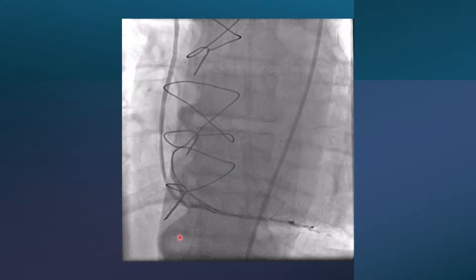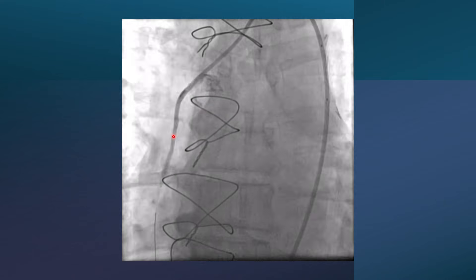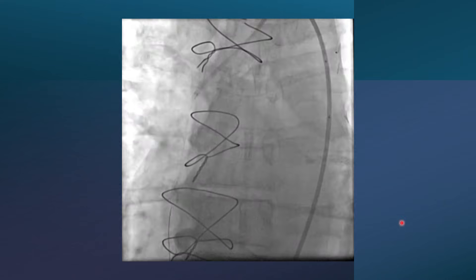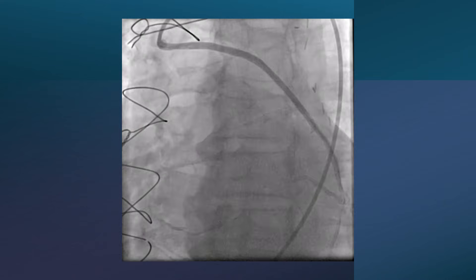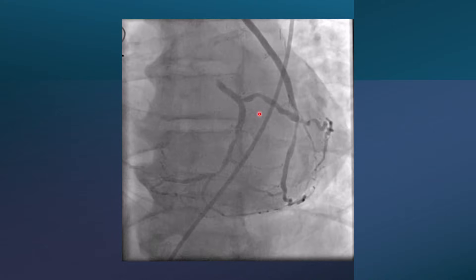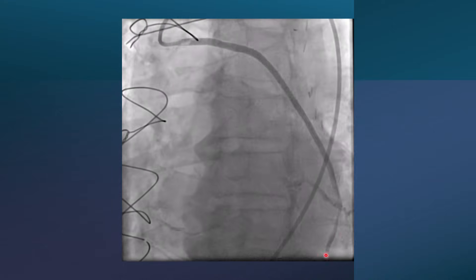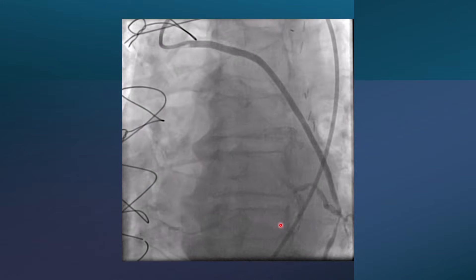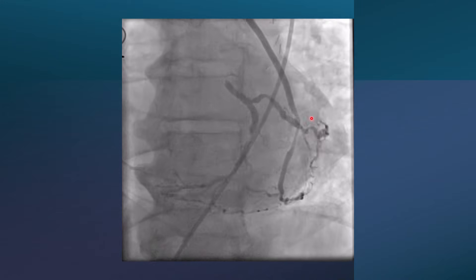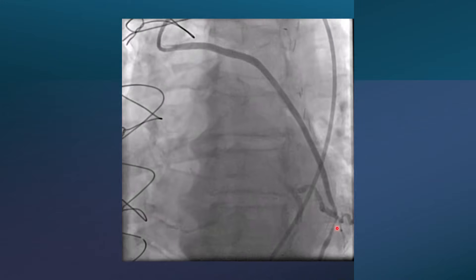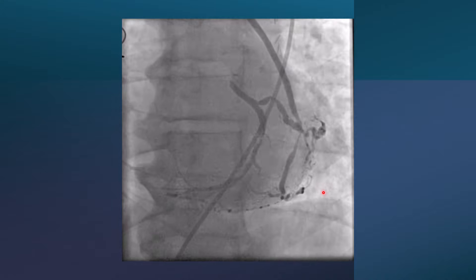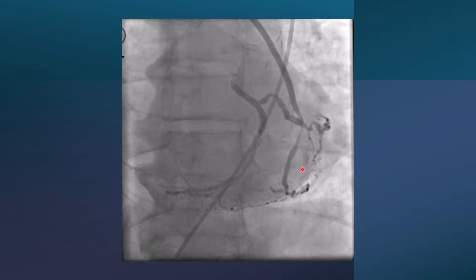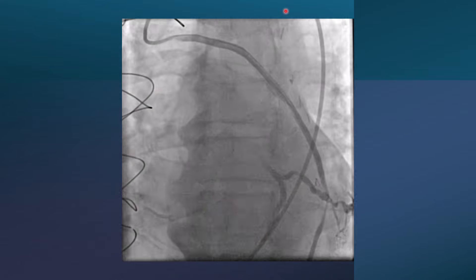This is the SVG to the RCA — it was stented by direct stenting at an outside hospital. And this is the SVG to the OM. The circumflex is a large artery with multiple branches, and the SVG is anastomosed to a large OM. However, there is a critical lesion following the anastomosis.